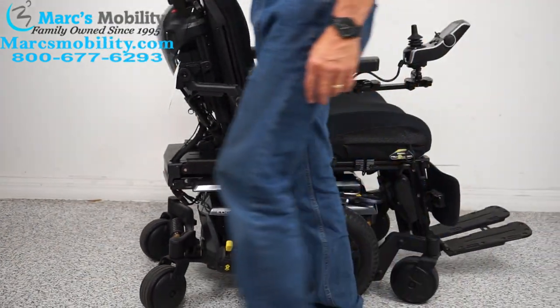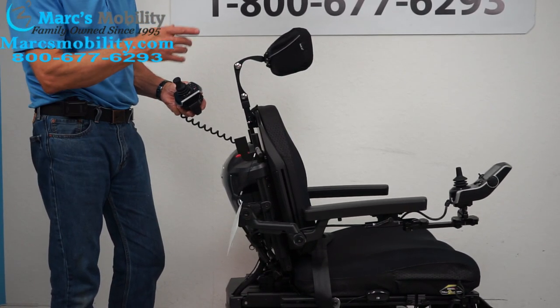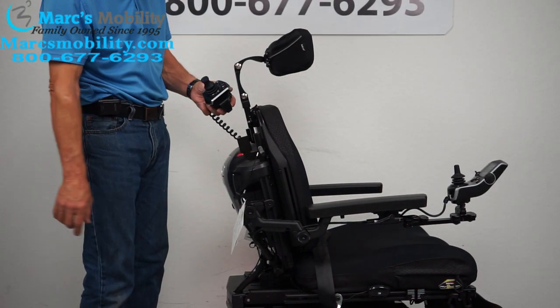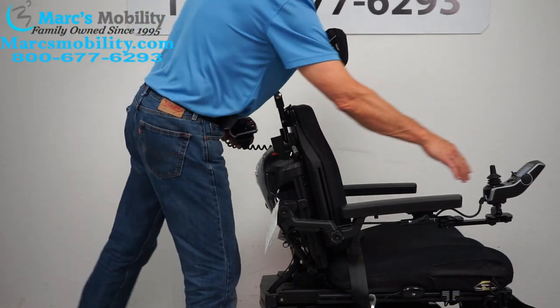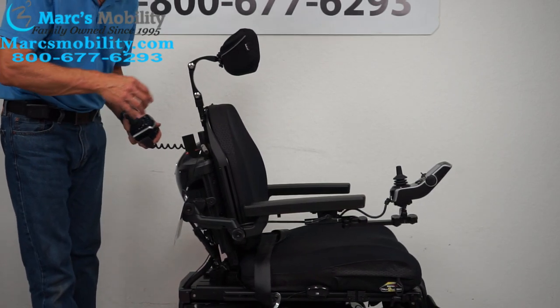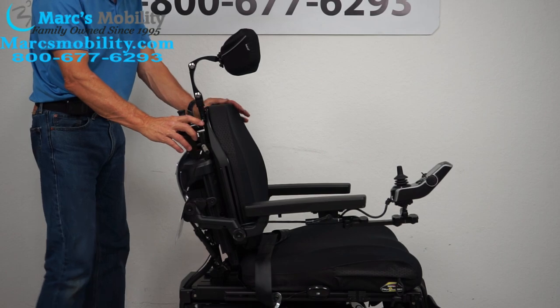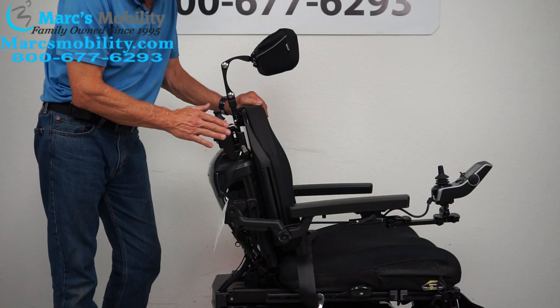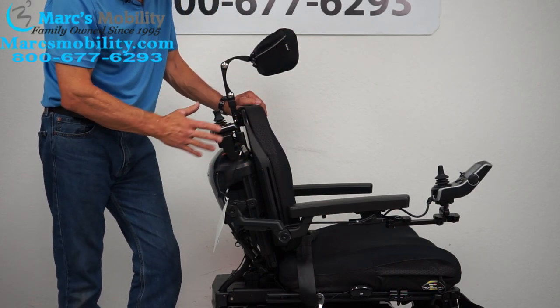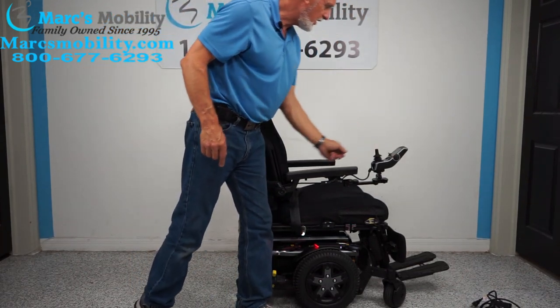This chair also has an attendant control right here on the back. I can walk behind this chair and switch the driving from the front joystick to the rear joystick. If you hit this button, the driving switches — you can no longer drive from the front, only from the back attendant control. If you have a loved one who can't drive, you can walk behind them and drive them around outside, go for walks, help them up a ramp without pushing. It takes a couple of days to get used to, but it's very useful.